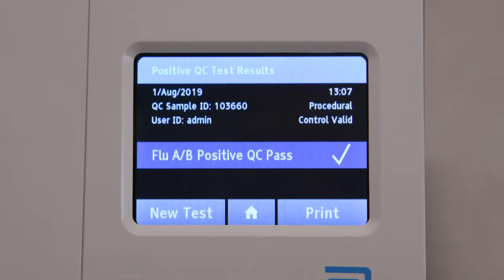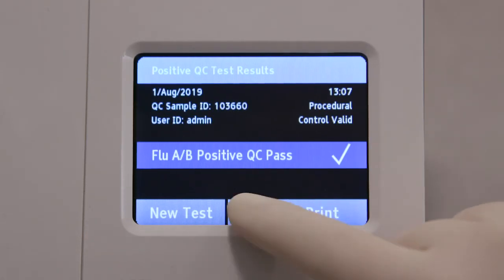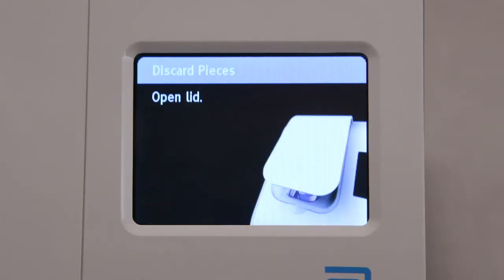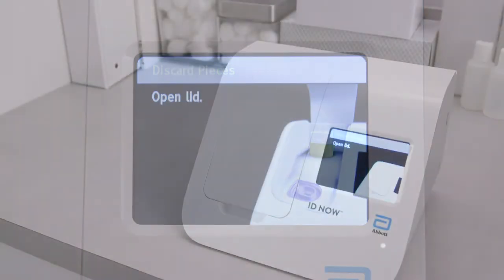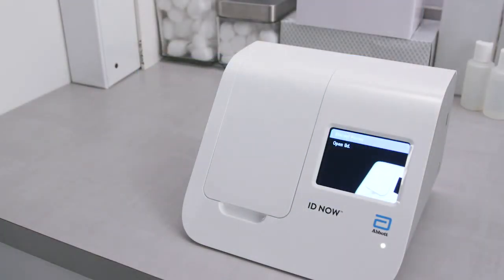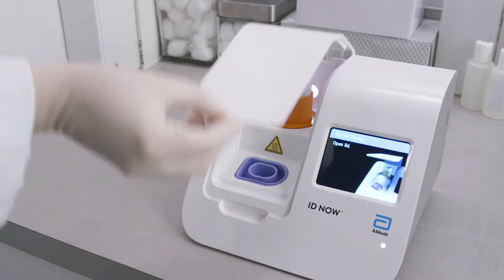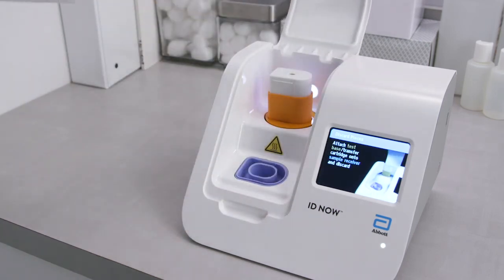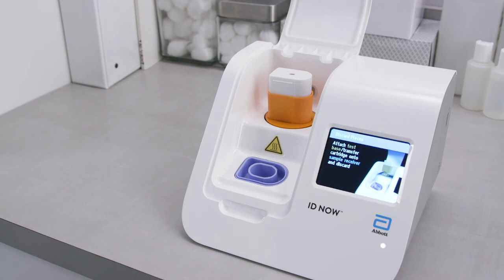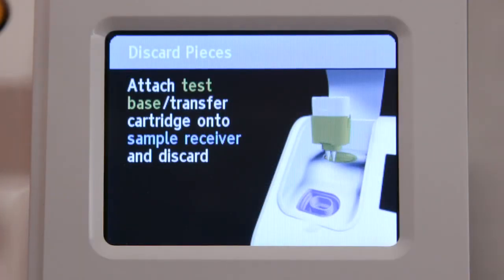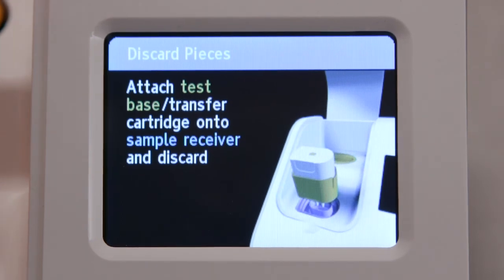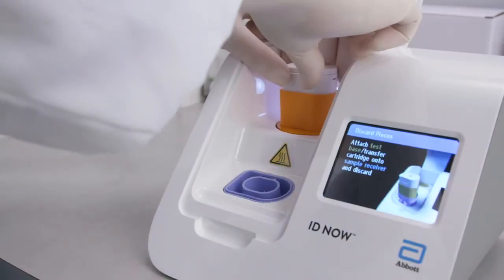After the test procedure is complete, the instrument will prompt you to open the lid and discard the used test pieces. It's crucial that you dispose of all the test pieces properly to maintain a work environment that's clean and free of contaminants. To begin the disposal of test pieces, remove the transfer cartridge and test base assembly and click it into the sample receiver as shown on the instrument screen.